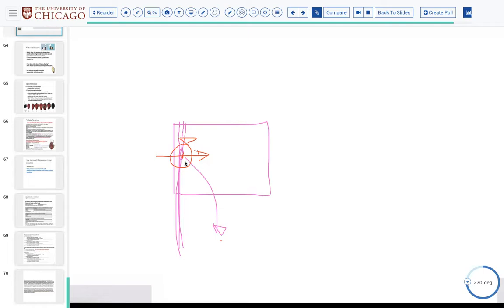So for these tiny vocal cord things, my suggestion is don't be afraid of going into the tissue, carefully, don't eat through it at the time of frozen. But if you get 2, 3, 4, 5 serial sections through it, that's actually better than being too superficial and then not getting much for permanent, because then you're not getting any information. I'd rather have you have the information at the time of the frozen than anything.